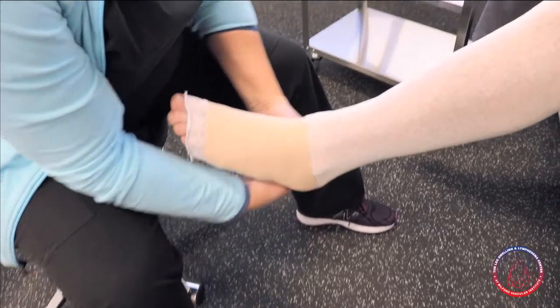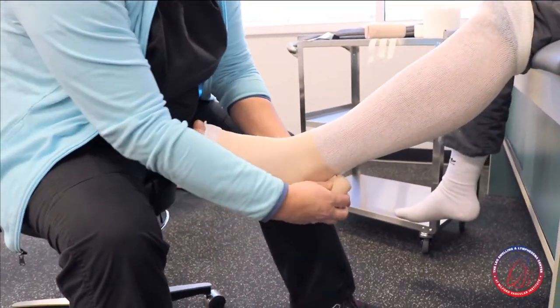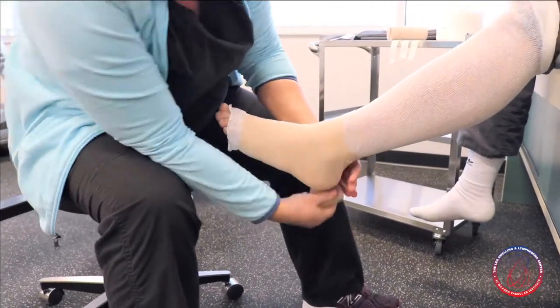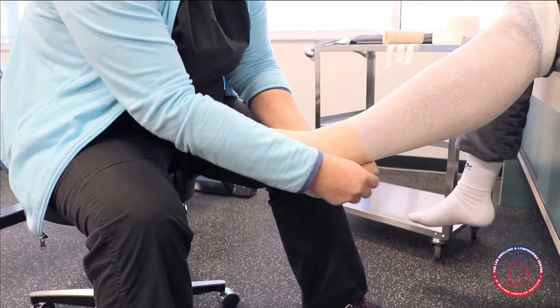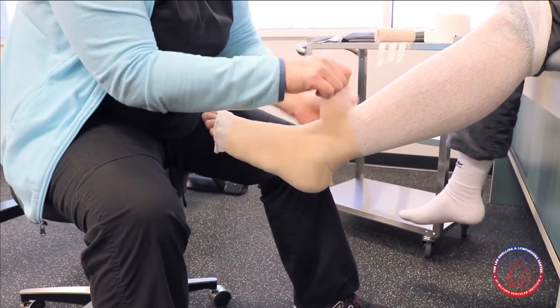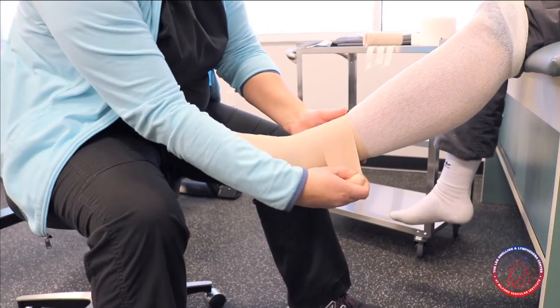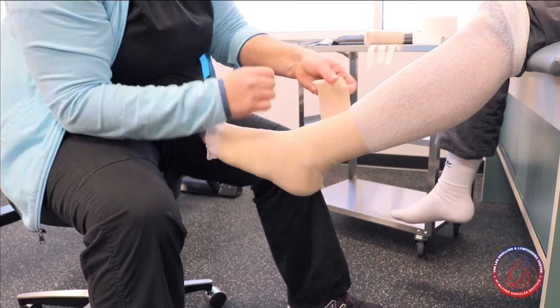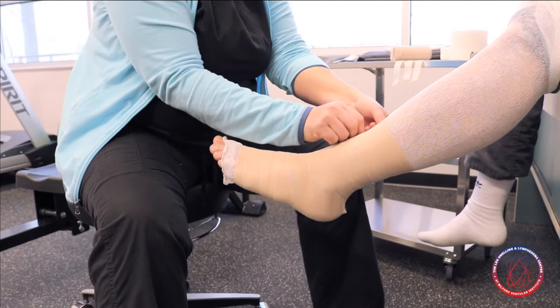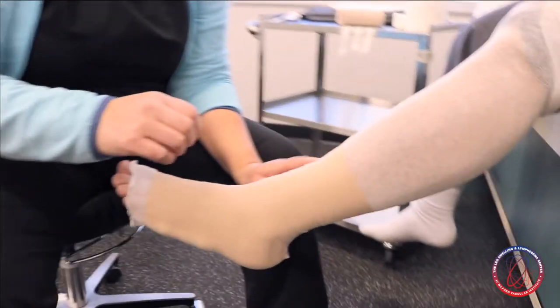When we get to the heel and ankle, the bandage is going to want to go around the ankle and we just follow that around, then continue working our way up the lower leg. We come up and across, around and back down, overlapping by about half of the bandage as we go. When we get to the end, we do a little tuck of the bandage to anchor it in place.